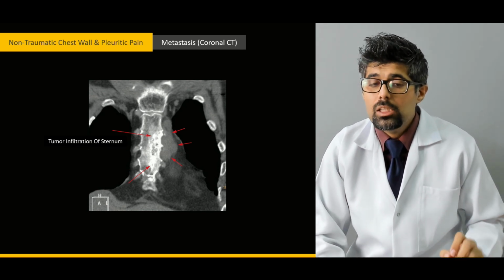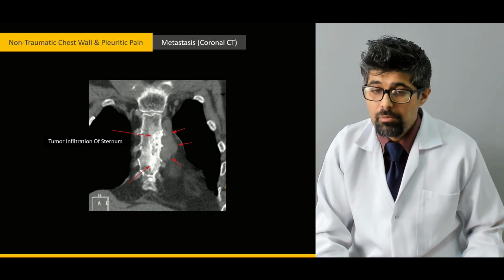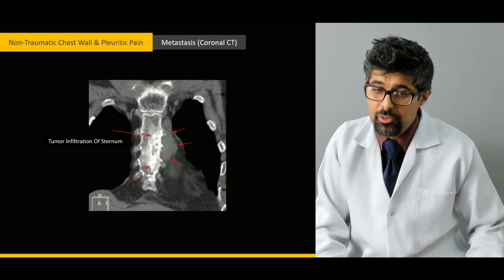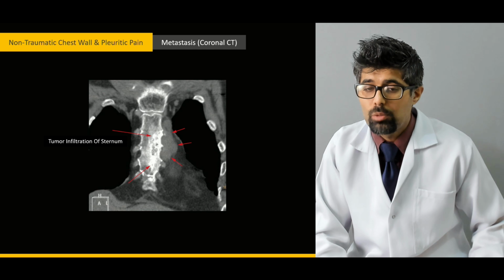As you can see, the tumor infiltration of the sternum is very, very bad, and it is very infiltrated with a lot of irregularities and a lot of focal points.